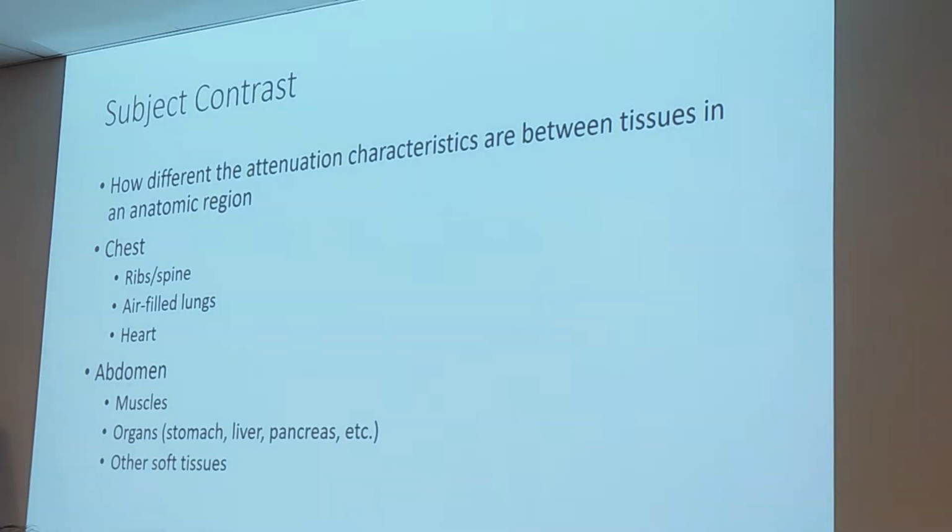So, when we talk about contrast, because these shades of colors, these blacks, whites, and grays, are based off the anatomy, are based off differential absorption, we call this subject contrast. Contrast caused by the anatomy, right, our subject.